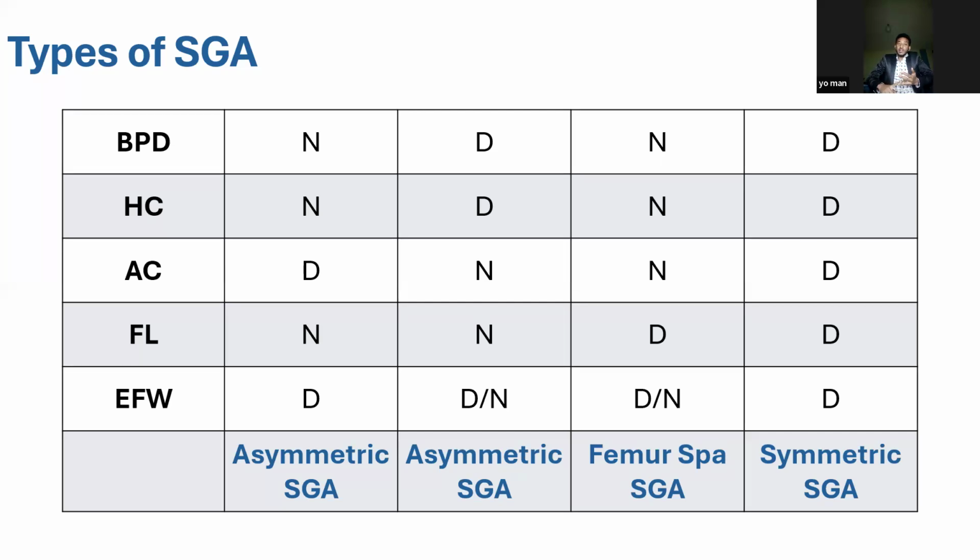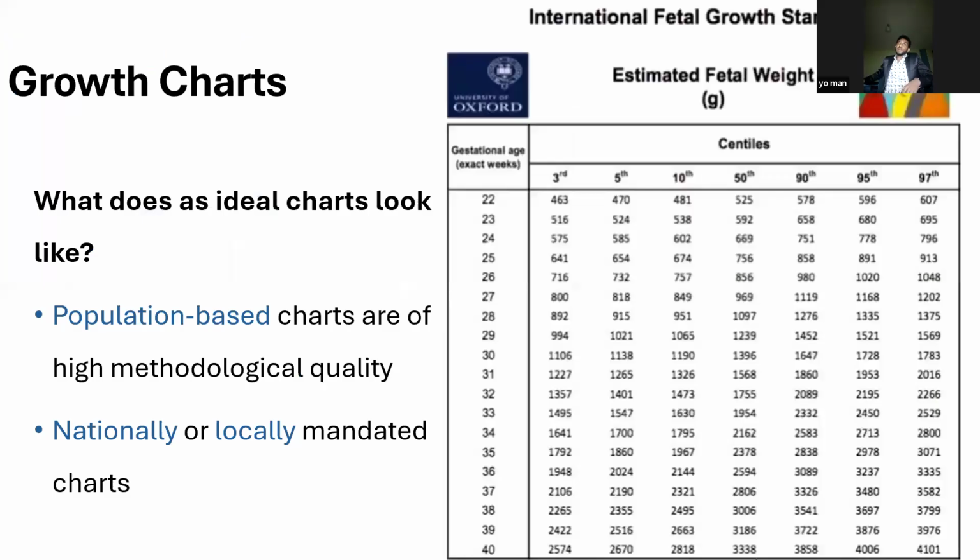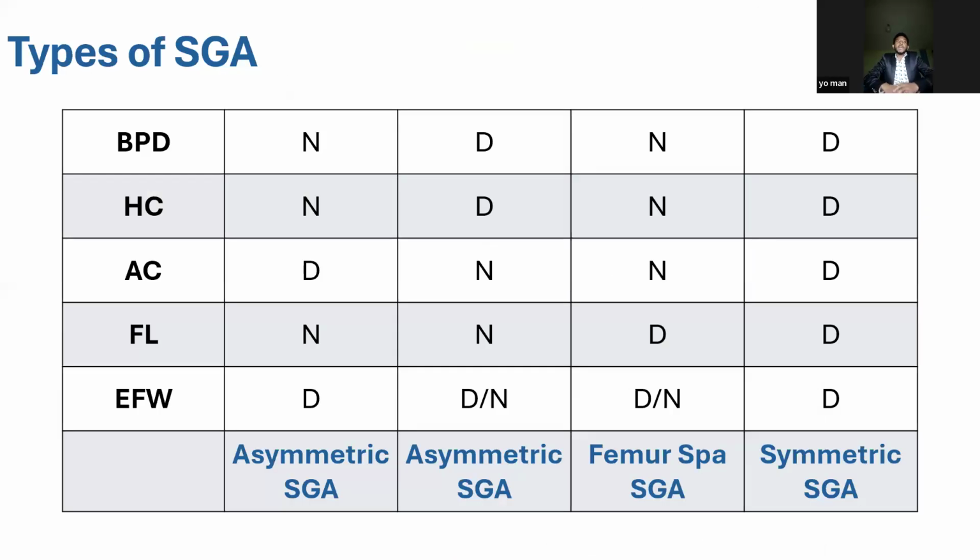We have the exact gestational age, we have the biometry, and we compare them. If, for example, at 30 weeks the weight is less than 1.1 kilogram, it's small for gestational age. It could be growth restricted, it could be constitutionally normal, but we all know for a fact that it is small for the exact gestational age.